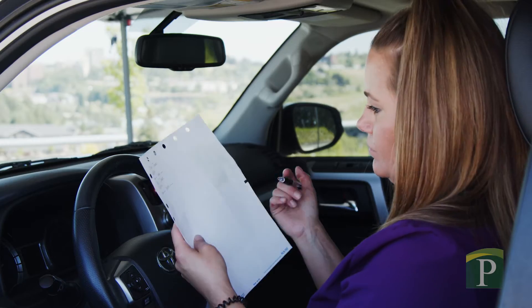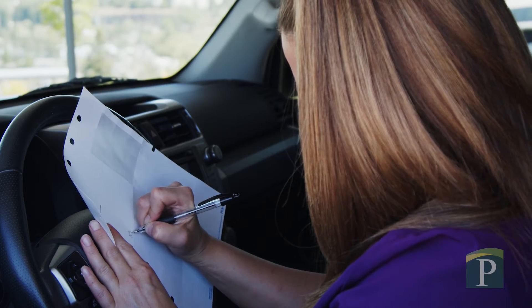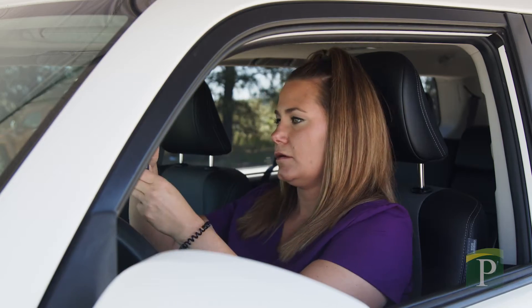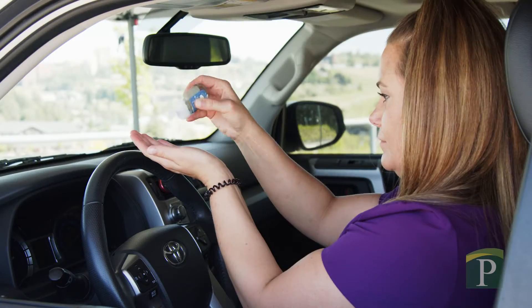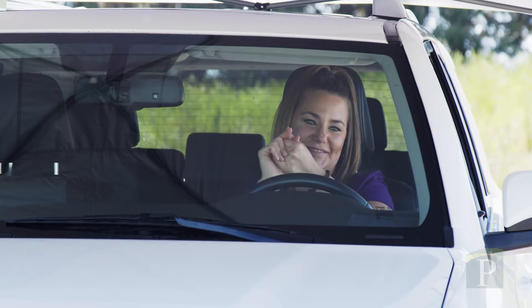First, record the date and time on one of the supplied sticker labels. This will help ensure your test is processed quickly and accurately. Next, take a moment to sanitize your hands. We want to make sure no foreign bacteria comes in contact with the testing materials.